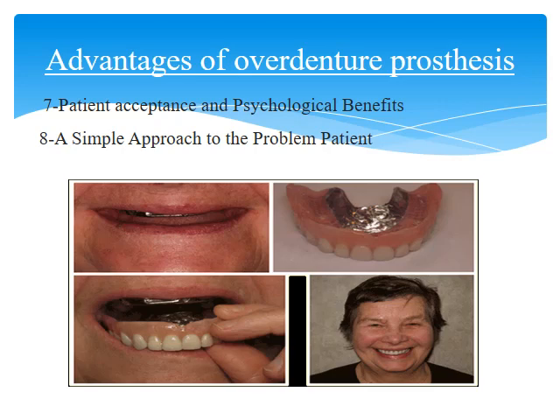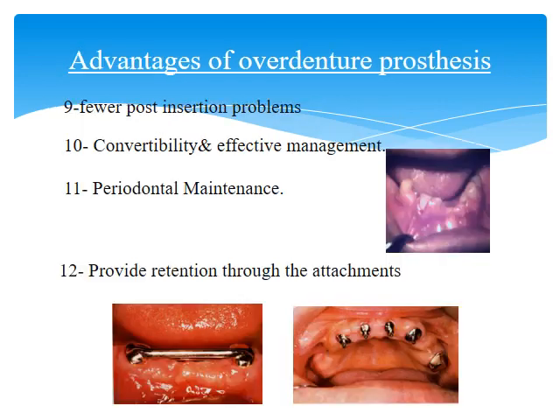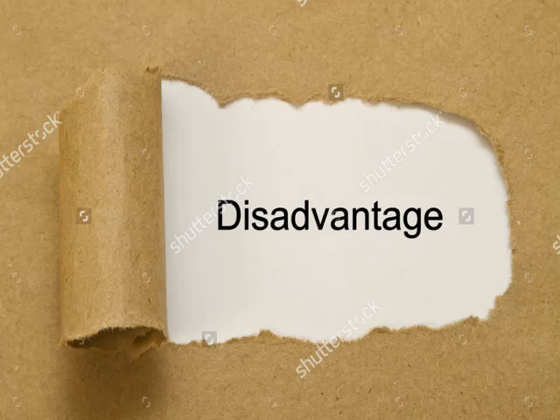Seventh, patient acceptance and psychological benefit. Eighth, a simple approach to the problem patient. Ninth, fewer post-insertion problems. Tenth, convertibility and effective management. Eleventh, periodontal maintenance and provide retention through the attachments.